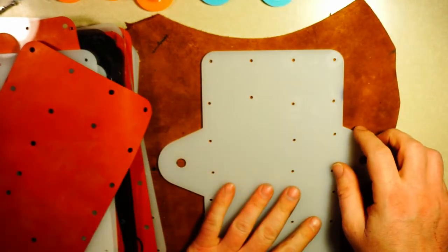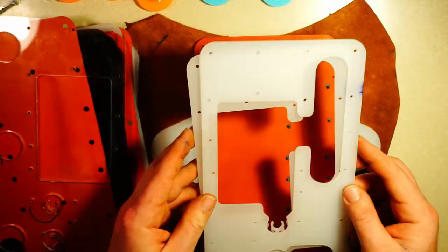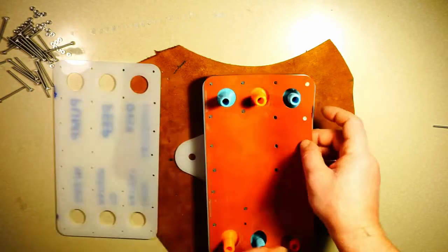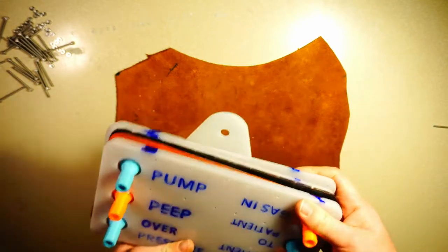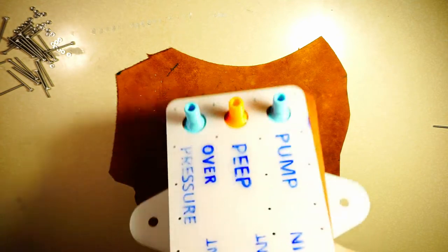That's it. So I'm going to put this together. I'll do it in high speed. And over here I've made some registration marks just so that I can assemble the valve quickly in the correct order. A Sharpie is an indispensable engineering tool.